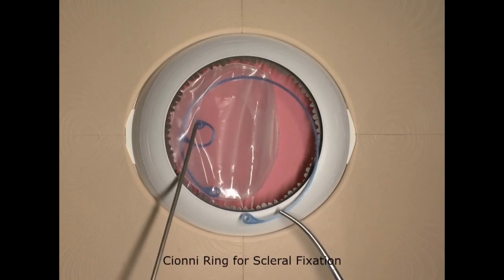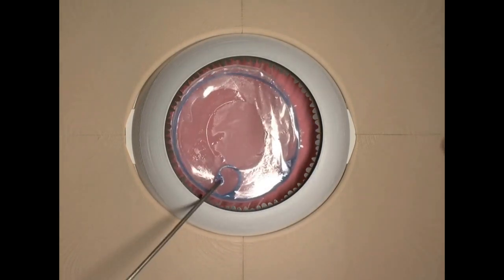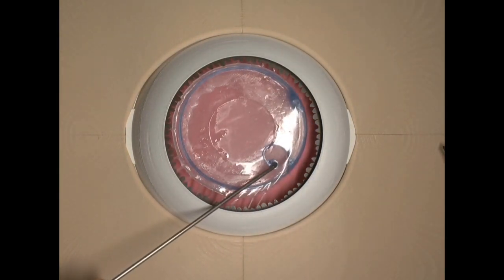With extensive zonular damage, we have to decide whether to preserve or to extract the capsule. If we decide to preserve the capsule, we use implants for sclerofixation.